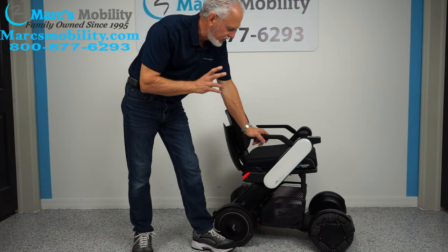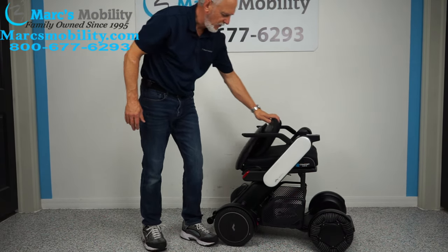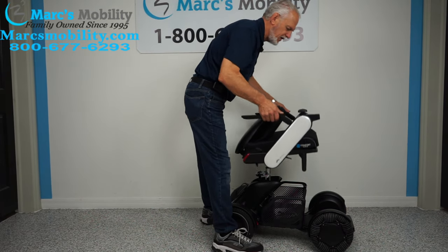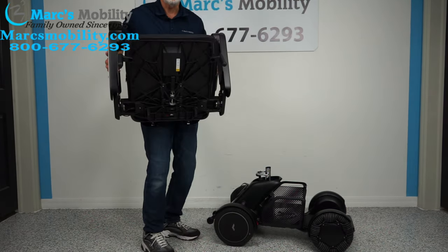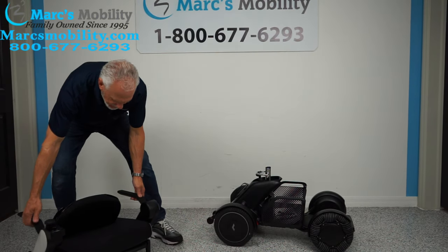The first thing you do when taking it apart is make sure the power is off, fold the seat down. They say in the manual: just grab the arms and pull straight up. As you can see, I grab the arms and pull straight up — it makes it very easy to pull the seat off.